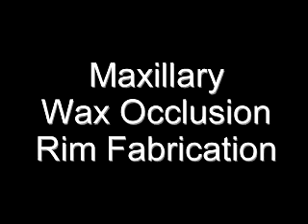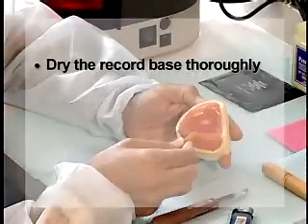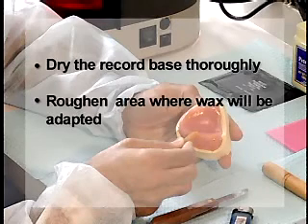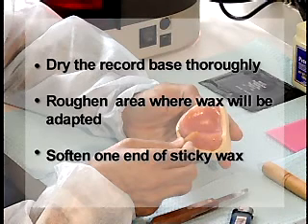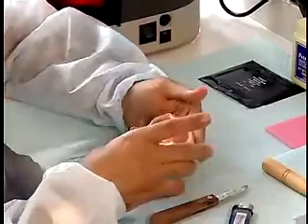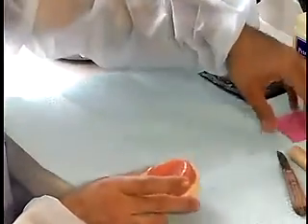Dry the record base thoroughly, as wax will not adhere to a wet surface. Roughen the area of the record base where the wax will be adapted. Soften one end of the sticky wax slowly over a Bunsen burner flame. Place the sticky wax over the ridge crest area of the record base.